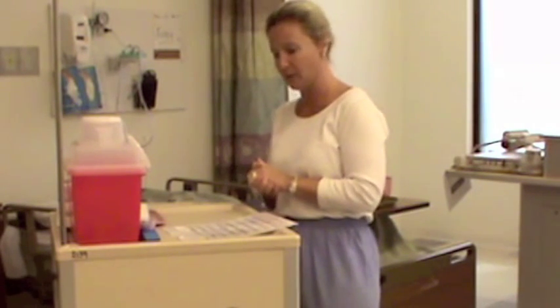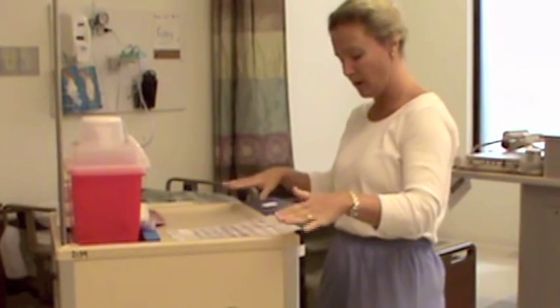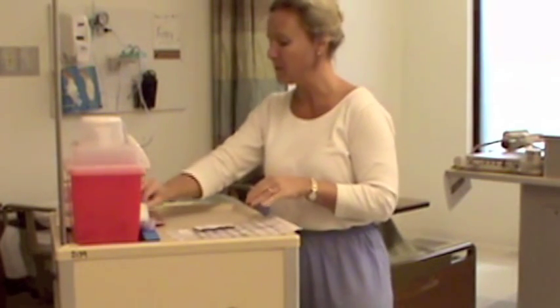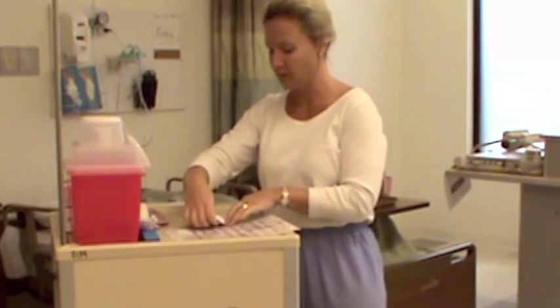Then I'm going to gather my equipment. I know I'm going to need my medication administration record, the cart where I have my medications, alcohol wipes, and 2x2s. For an intramuscular injection, I have to look for the correct size syringe and size needle. For needles, an intramuscular injection usually requires a 1 to 1.5 inch length needle, depending on what muscle group you're looking at and the size of the patient.